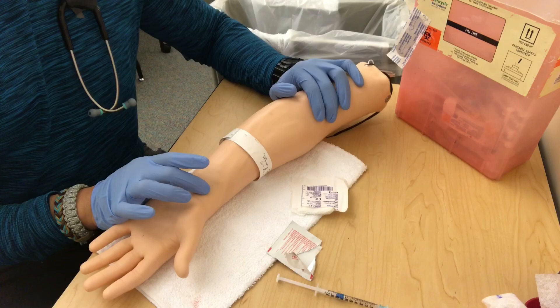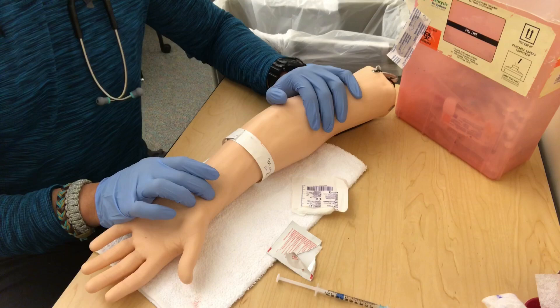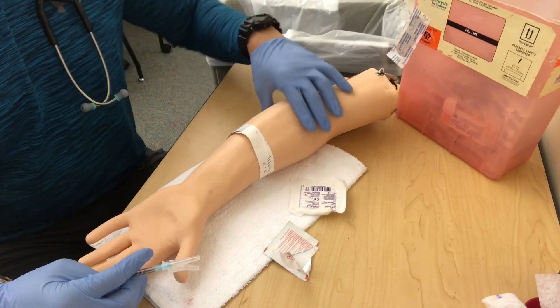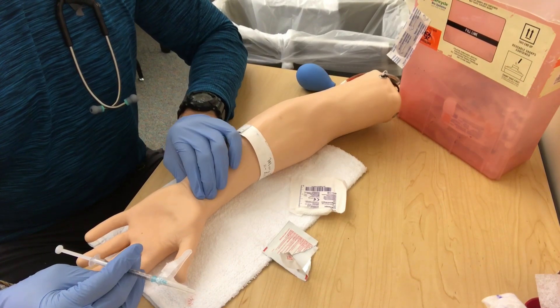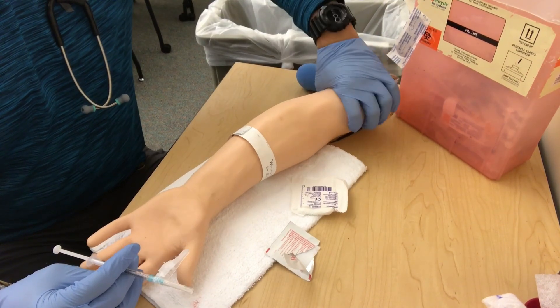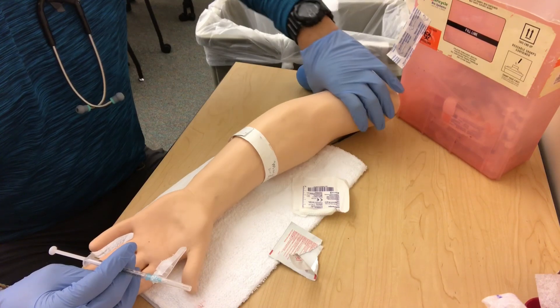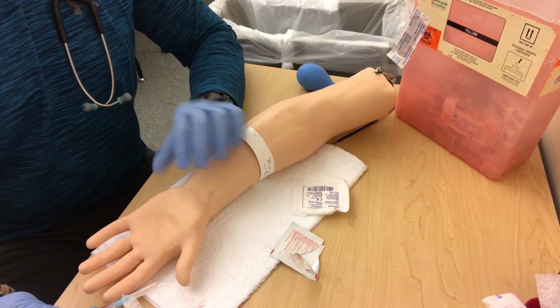The artery is pulsatile and stronger than the vein, so in that way it's easier, but it's still tricky because you're not looking for it — you're feeling for it. The good thing about arteries is they don't roll. The artery really doesn't move much and is strong enough to withstand a blood pressure cuff. I like to make sure they're not getting a blood pressure reading when I'm doing it — just anything that helps.